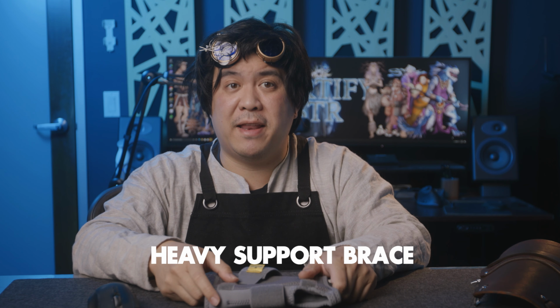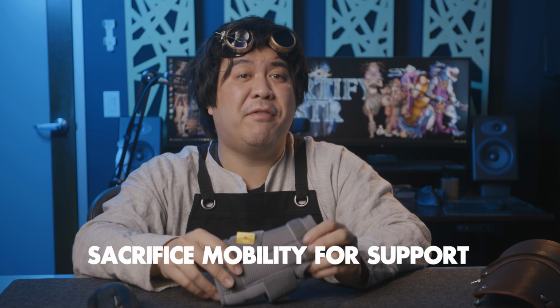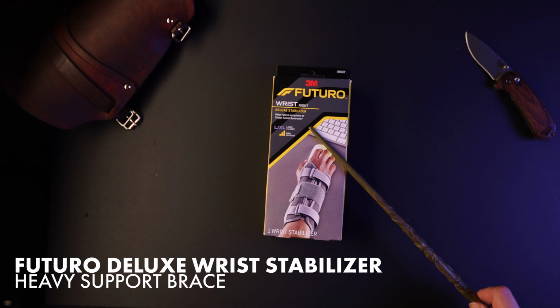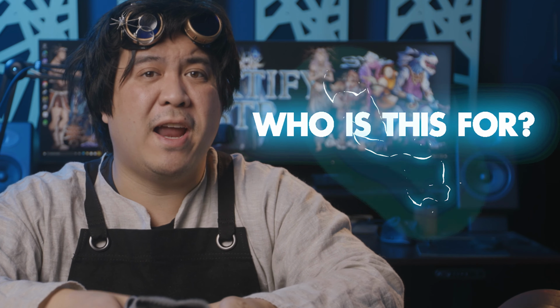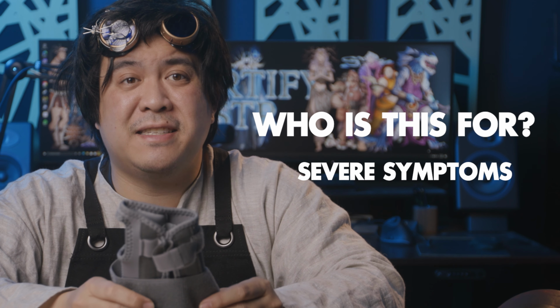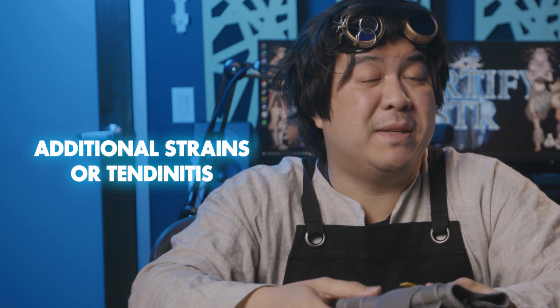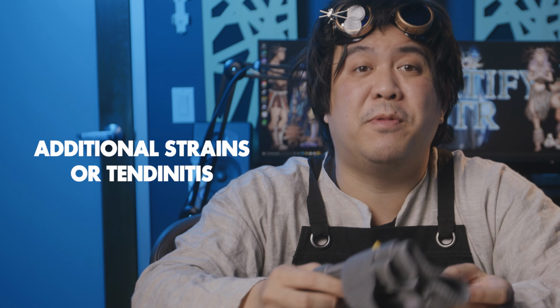Now for the big boy, the heavy support brace that I recommend. These types of braces usually tend to limit mobility a lot, but have a large amount of support to keep the wrist in place. This one I have here is called the Futuro Deluxe Wrist Stabilizer. Now who is this wrist brace for? If you have more severe symptoms like really bad pain and tingliness, then you really need to keep that wrist in neutral for the whole day. This is your choice. If you have other issues besides carpal tunnel, such as muscle strain or tendonitis, this is also a really good choice.